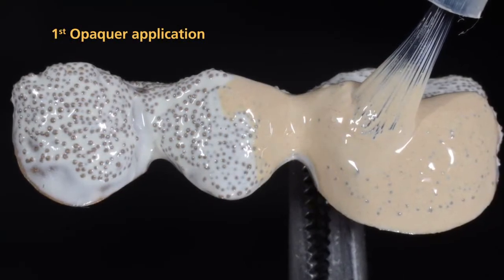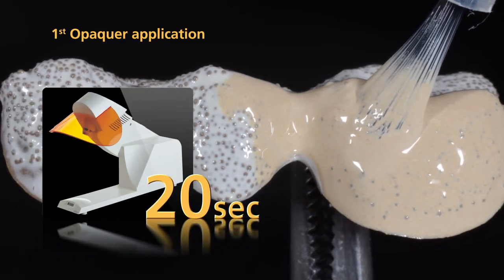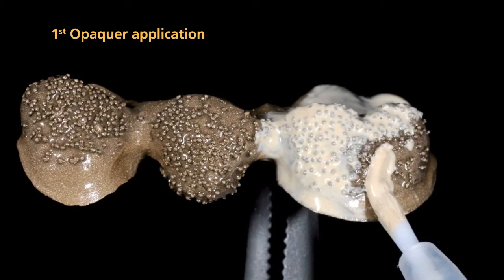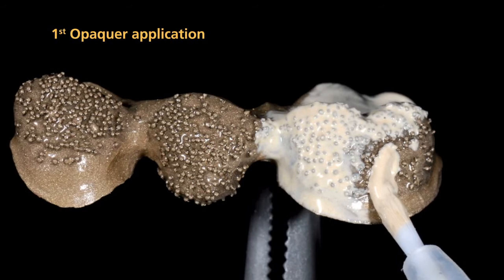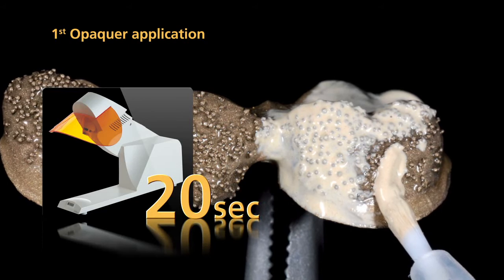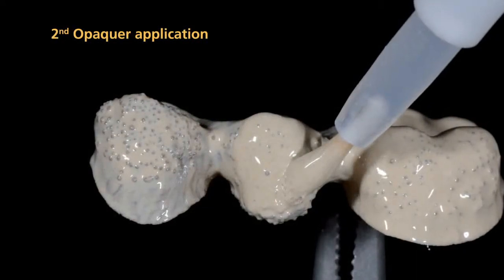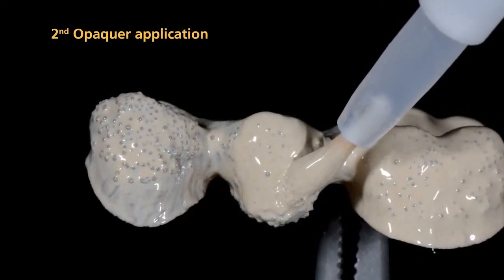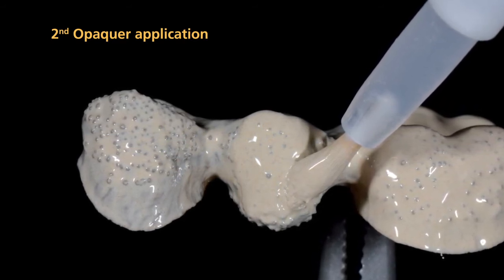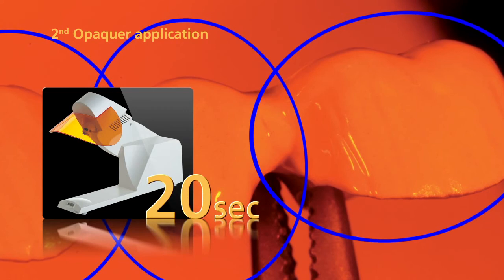Apply the first layer of opaquer in a thin coating using a brush. Pre-cure the opaquer for 20 seconds with the quick. If you do not use SR-NEXCO retention flow, apply the first layer of opaquer in a thin coating to the metal framework, then pre-cure each segment for 20 seconds with the quick. Apply the second layer of opaquer so that the metal framework and, above all, the retention beads are now entirely and fully covered with opaquer. Subsequently, pre-cure each segment again for 20 seconds using the quick.